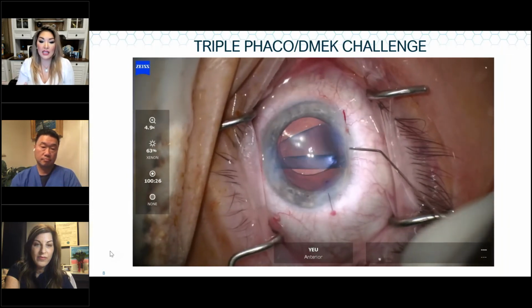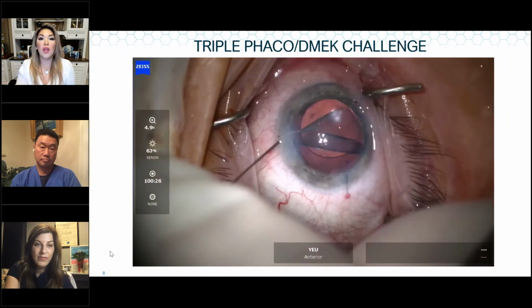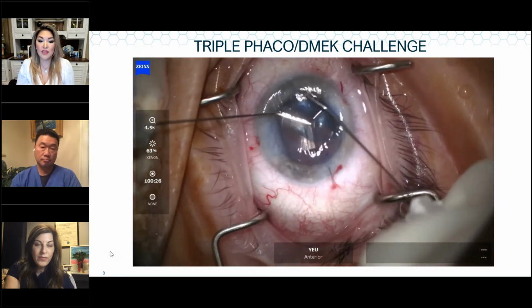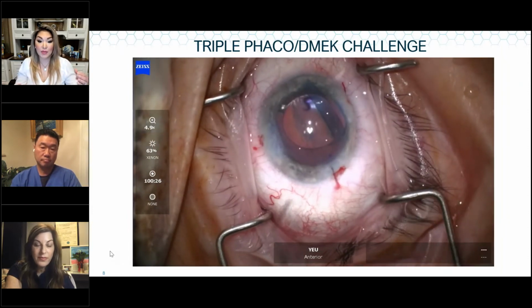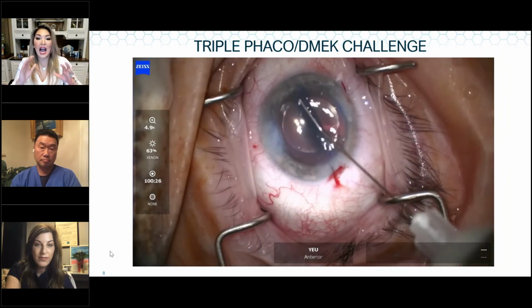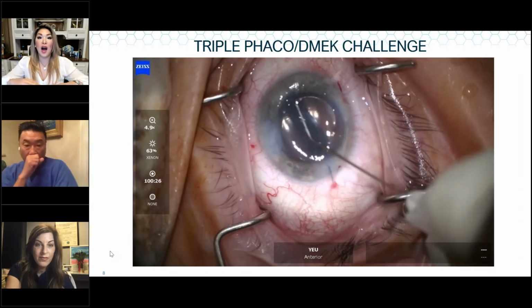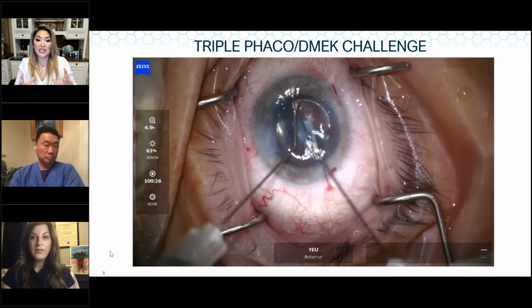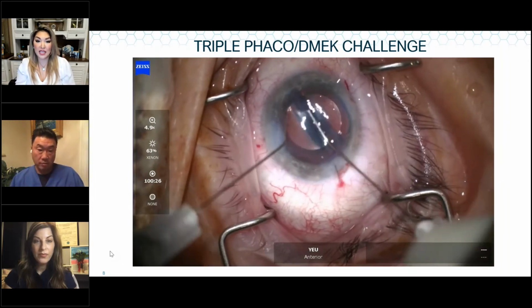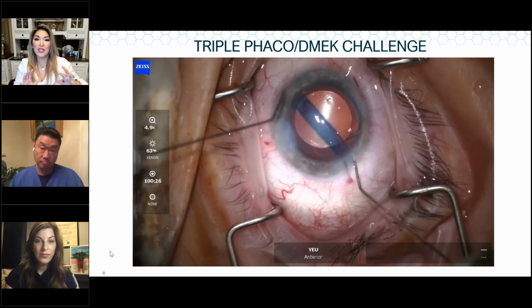And I used a one-piece lens with a gummier hydrophobic acrylic material. As you can see here, while this is a relatively normal eye, minus the fact that the Miostat or Miochol is not working super well, and I didn't even give that any consideration, every time I try to shallow this lens, even though I've oriented the haptic in the proper meridian, just because of the material itself and the eye being what it is with the AC, I can't get it quite shallow enough to make it easy for me to unscroll without the IOL coming up. And I didn't want the actual optic to pop out of the bag. So as you can see here, this is a fine dance. I've turned a routine triple case into a more complicated case for myself. I tried multiple times to find that perfect balance where I could get the IOL to not move much.